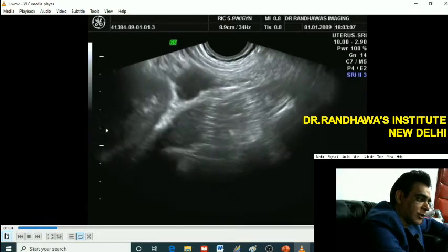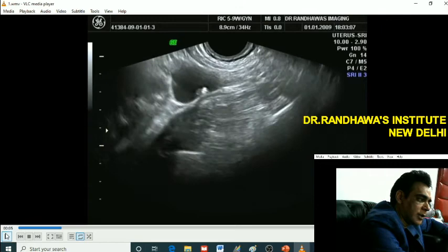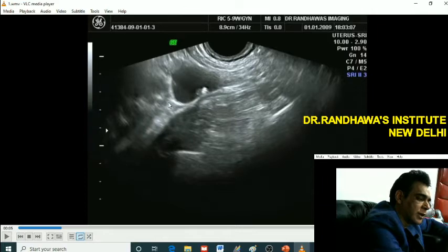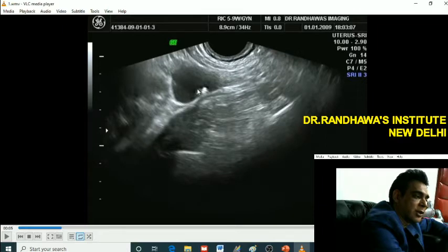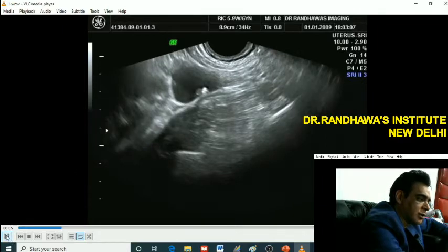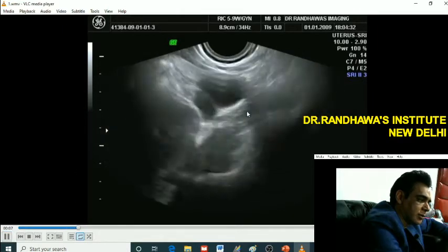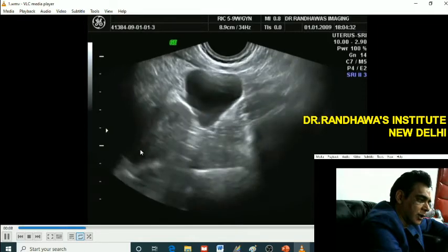What else can you make out? I can see the kidney. Not very clearly focused, but the reason is that we are concentrating on this. This is the high frequency probe, TV probe which we are using per abdomen, and you can see this is that irregular area.